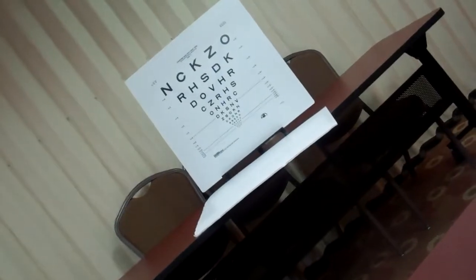I'll let you know what the other functions do as we get going. I don't want to overwhelm you at the beginning, so we'll just concentrate on zoom, contrast, and reset functions. If you don't have any questions, we can get a sense of what your vision is like normally. There's a chart about 10 feet away. Are you able to make out anything on that chart?